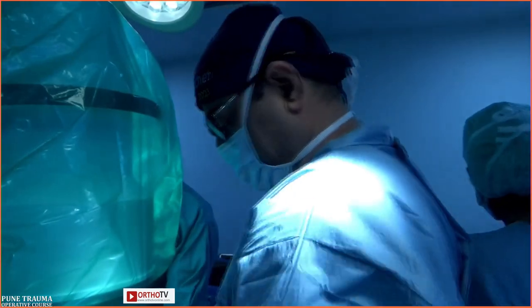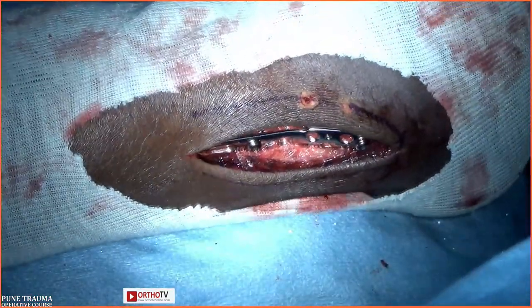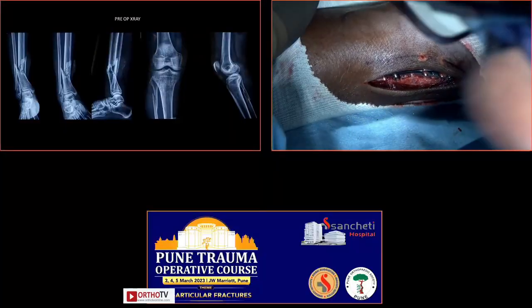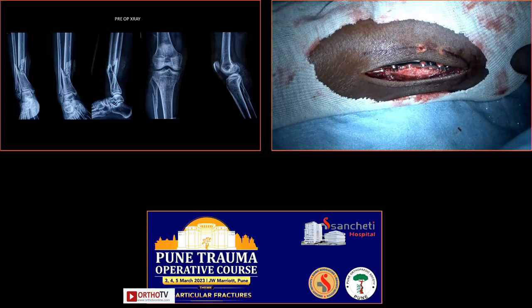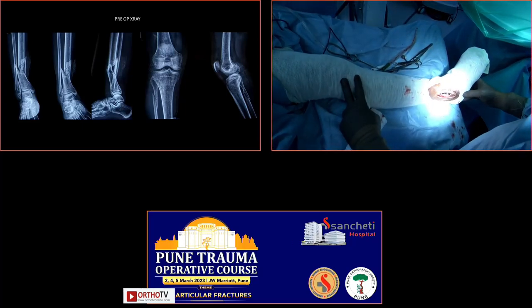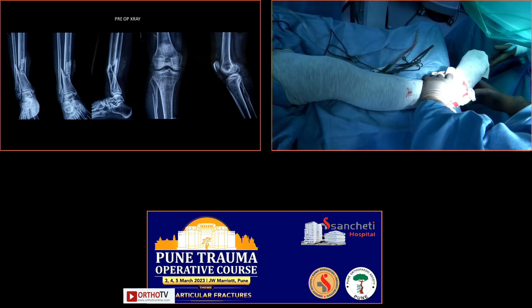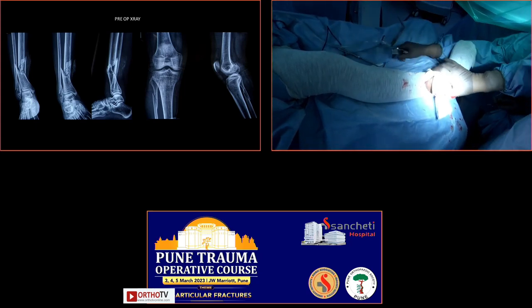As we had decided on the plan, I have started with the fibula plating. If you can see this, I have begun with the fibula plating. But meanwhile, let me move on to the x-ray.